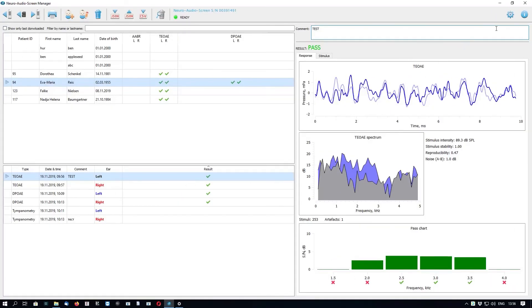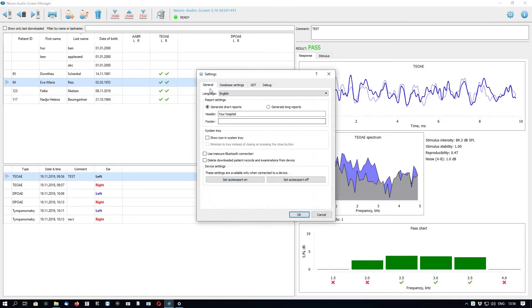To access program settings, click the gear icon button in the top right corner called Program Settings. There is a settings window with several tabs. In the General tab, you can set the software language, configure report settings such as short or detailed reports, and customize the header and footer. For example, in the header you can type in the name of your hospital or clinic, along with other advanced settings.